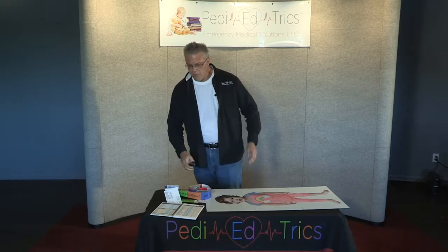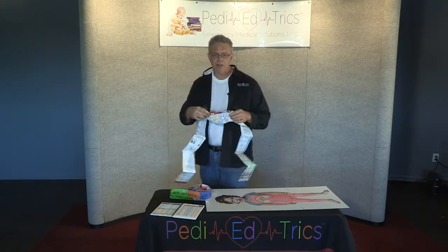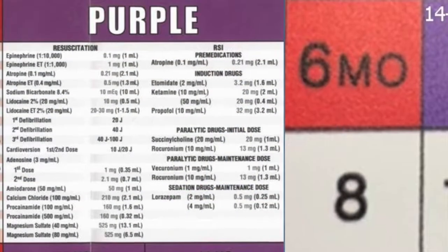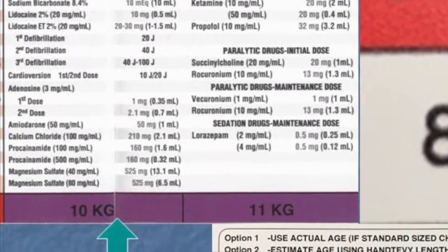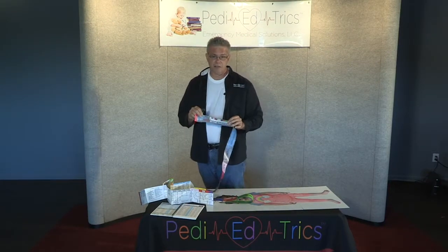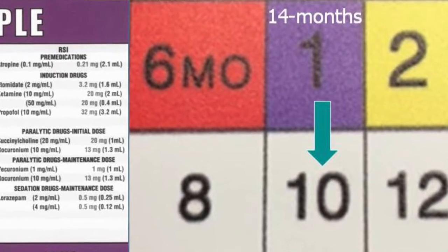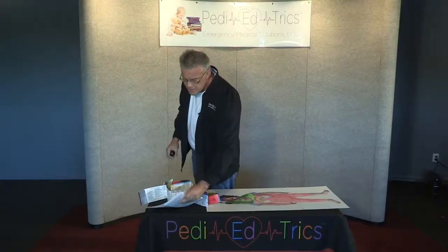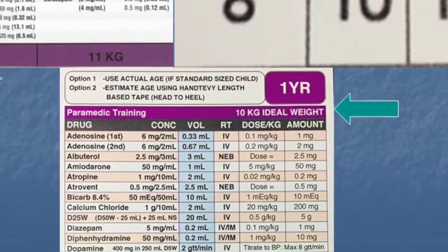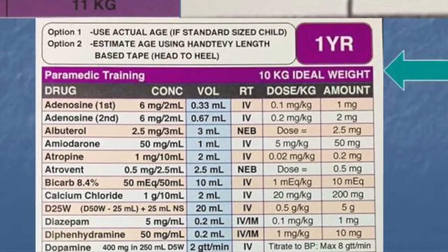If you take a look at your Broselow tape for purple on one side, because remember that it's only listed the weight on one side, so if you don't see what you're looking for on one side, flip it over, it's on the other. And if you look at a Broselow tape, it says that a purple kid should be 10 or 11 kilos. If you look at the Handtevy tape, again, remember the end where it says start here at the child's head? Next to the big arrow is where it's got that cute little chart. And the cute little chart says one-year-old purple should weigh 10 kilos. Or if you look at the book or the app, it'll tell you that a one-year-old is purple. And underneath the purple box, it says that a one-year-old ideal body weight is 10 kilos.